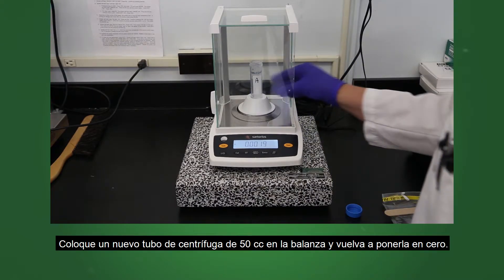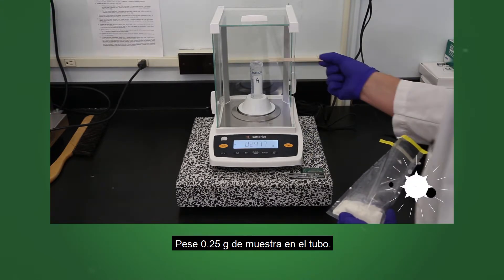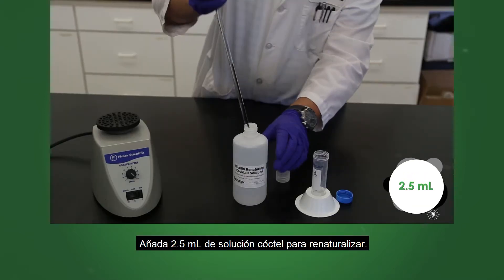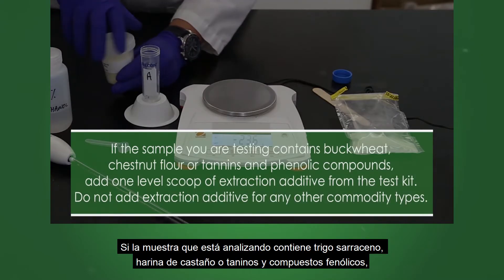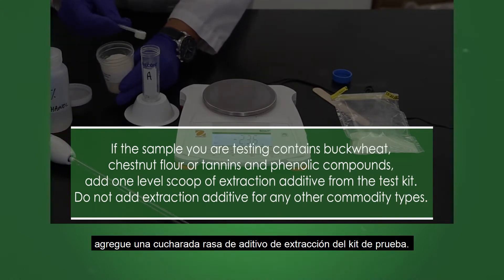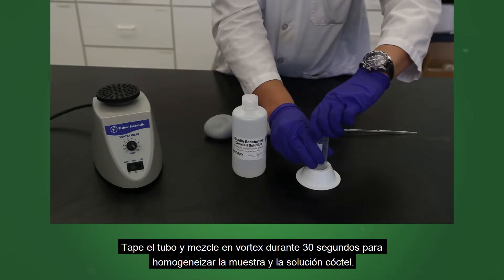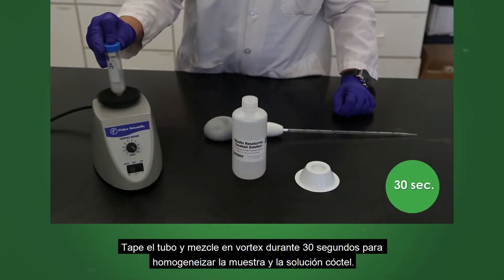Place a new 50 cc centrifuge tube on the scale and zero out. Weigh out 0.25 grams of sample into the tube. Add 2.5 milliliters of Renaturing Cocktail Solution to the sample. If the sample contains buckwheat, chestnut flour, or tannins and phenolic compounds, add 1 level scoop of extraction additive from the test kit. Do not add extraction additive for any other commodity types. Cap the tube and vortex for 30 seconds to homogenize the sample and cocktail solution.